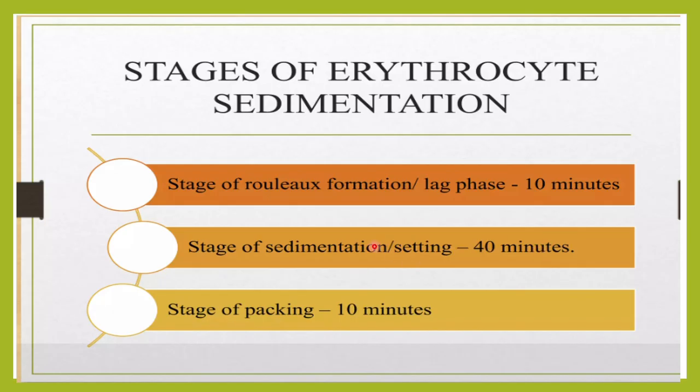The stage of Rouleaux formation is called the lag phase. It takes around 10 minutes. Then the actual stage of sedimentation, the settling stage, takes around 40 minutes. And then comes the stage of packing, where they are actually packed together, and that takes around 10 minutes. So 10, 50, 60. So ESR in millimeters is measured at the end of 1 hour because of these stages, and it is a standardized time which we take.